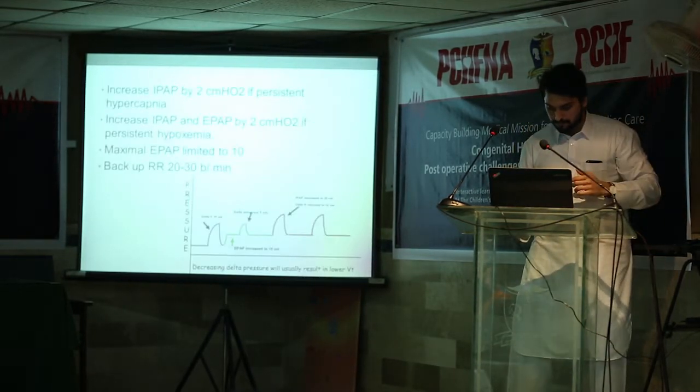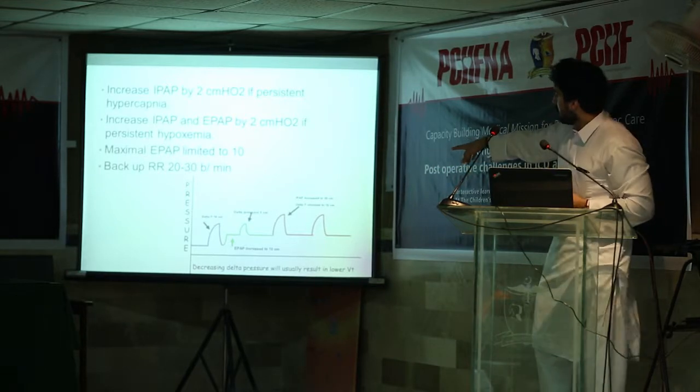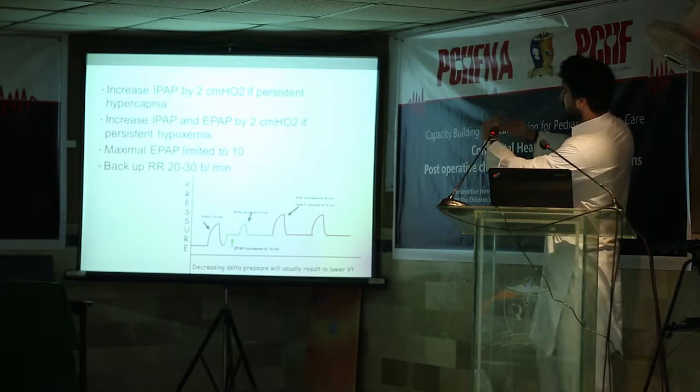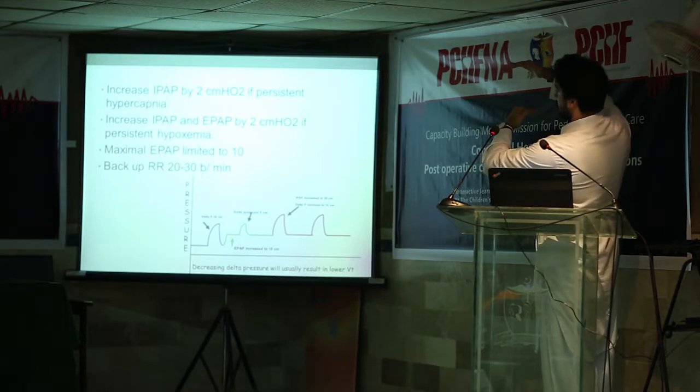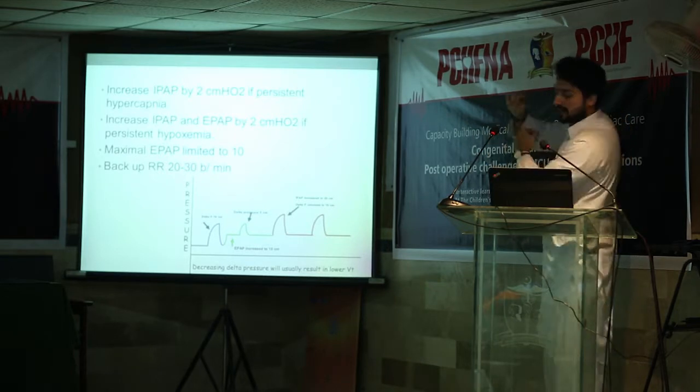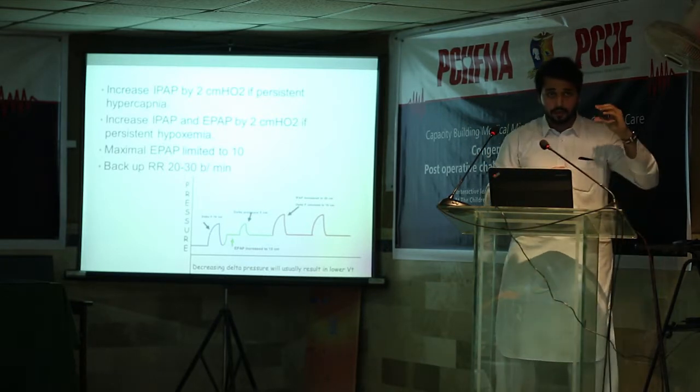I will show like this. So like here, we increase only the EPAP, the green one. This is my delta now, right? I increased only the EPAP, so my delta is low now. And I told you, delta is the one important for the tidal volume.